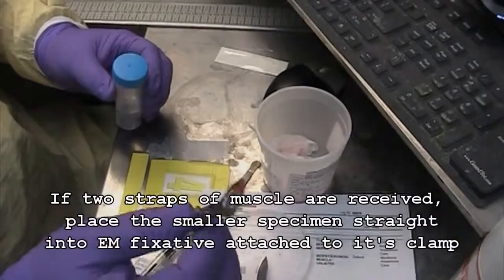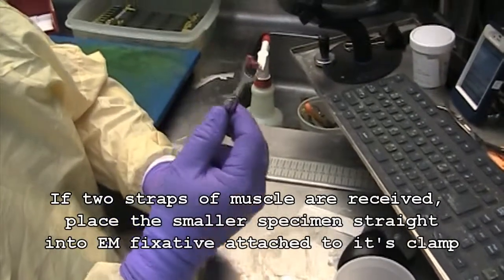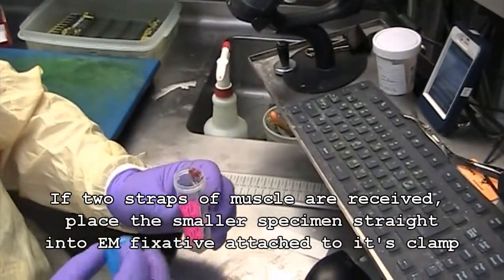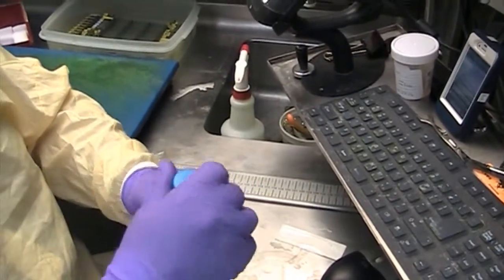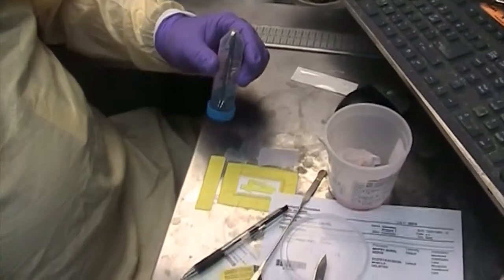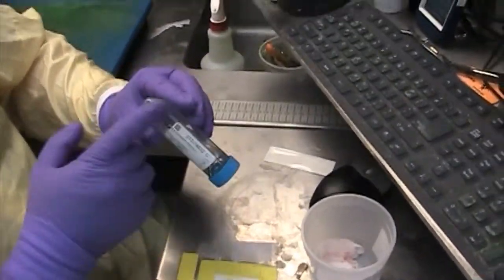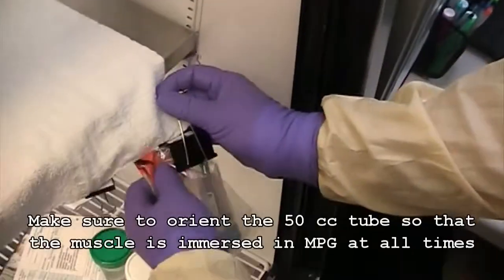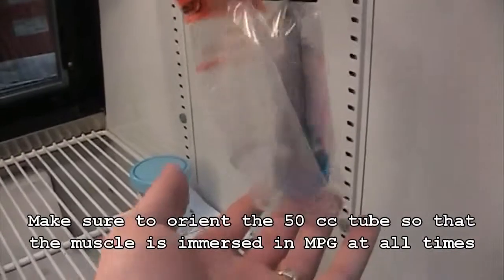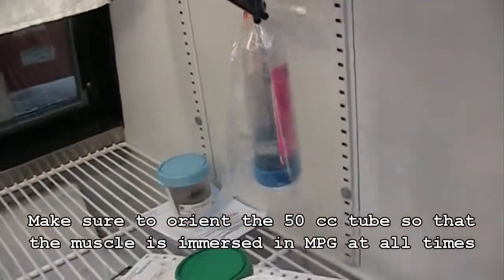So this was the remaining clamp that we left. Okay. Goes in the EM fixative in the conical tube, upside down like that. Put the lid on tight, invert it, and that's your part C. In the cooler next to Danielle. Make sure it remains upright so the fixative is always on the tissue.